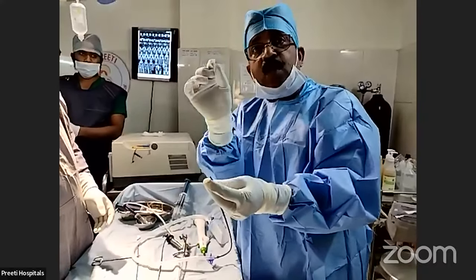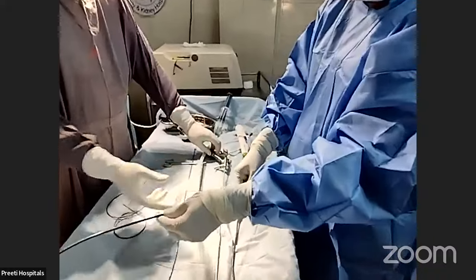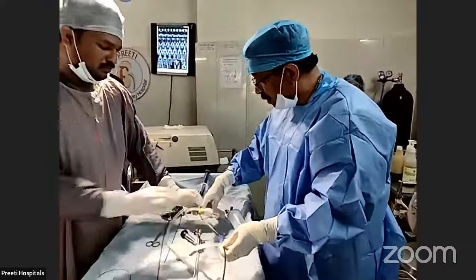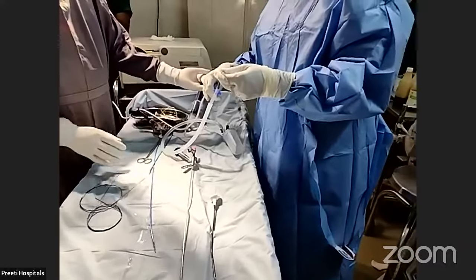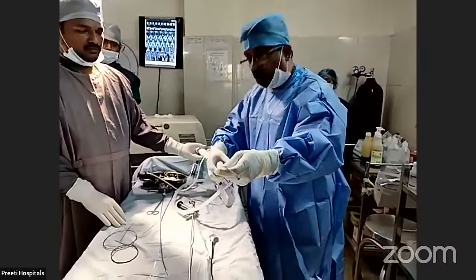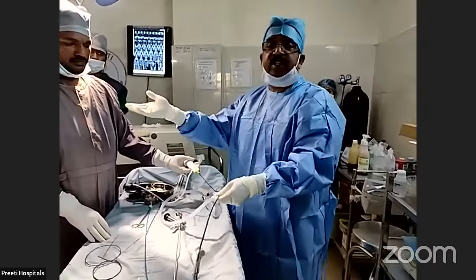And at the end, the small fragments you keep, by removing this scope up to this end, like this, here is the bifurcation. The fragments will go here, and you come here and insert again. So what is the problem? Inserting this, you have to hold it with somebody, and inserting this into a sheath for 50 centimeters is the time. So this time should be fast, so that you come back. And all the fragments, when they are coming out, like in PCNL, they won't come out easily. You have to exert some pressure and come slowly and put it down. That we will see now.